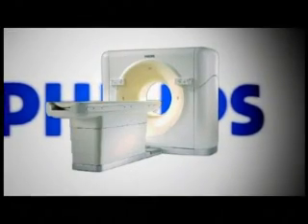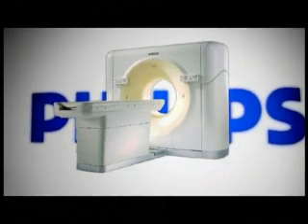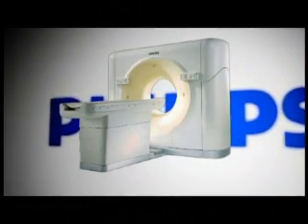Hello, my name is Dr. Robert Manske. I have been working with Philips research on cardiac CT reconstruction algorithms for multi-slice cone-beam CT scanners for 6 years, introducing some of the most powerful reconstruction algorithms available.